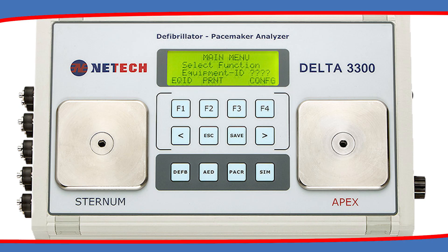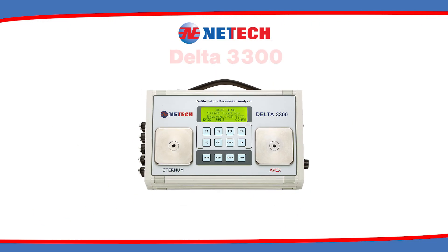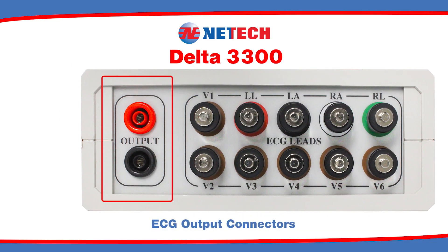The defibrillator paddle contacts are marked sternum and apex. The left side of the unit features 10-lead universal ECG, as well as high-level ECG output connectors.